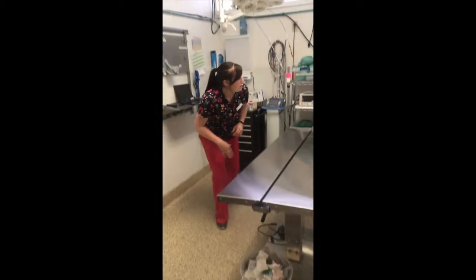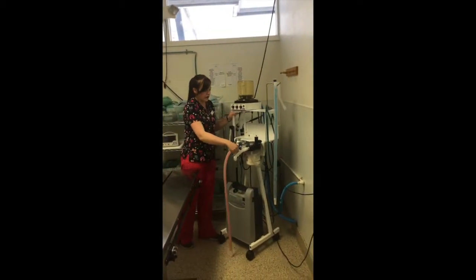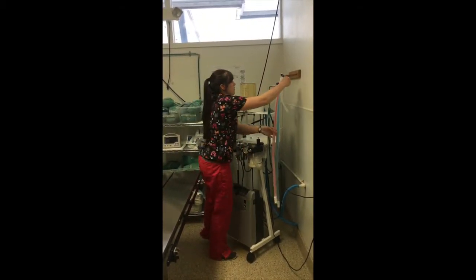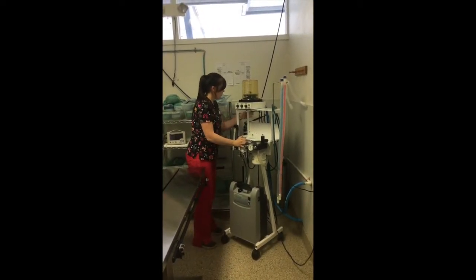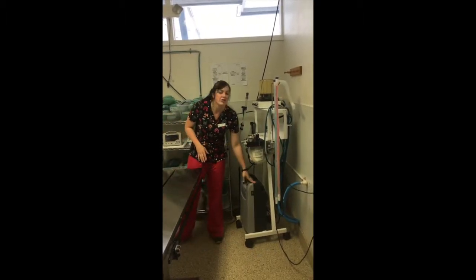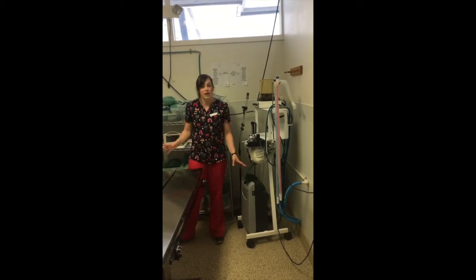Alright. So now that that's done, we want to go ahead and take apart our anesthetic machine. So we don't want the tubes hanging off the front because they can get damaged. So we're going to hang those up. Push this back so it's out of the way. Alright, and oxygen has been turned off. This is an oxygen generator, so we've turned that off for today, so there's no more oxygen going to this room.